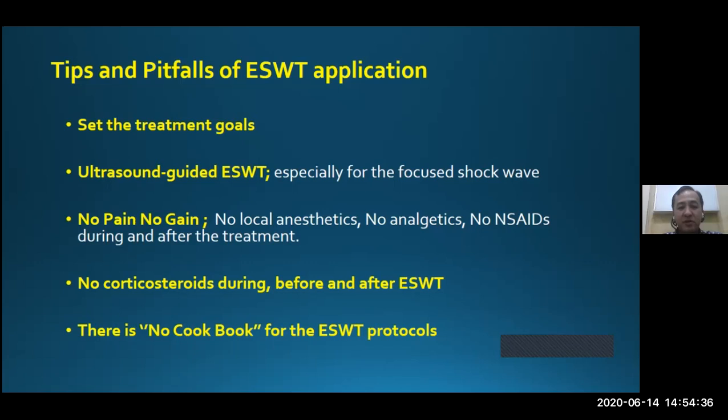So ultrasound is not only used for needle guiding, but also for shockwave and other physical modalities. You can also use ultrasound to guide electrotherapy, ultrasound diathermy, or laser. Ultrasound guidance is not only for the needle, especially for physical medicine and rehabilitation doctors or physiotherapists. And especially for focused shockwave, where we have to precisely target the shockwave, we have to use ultrasound before performing the focused shockwave.